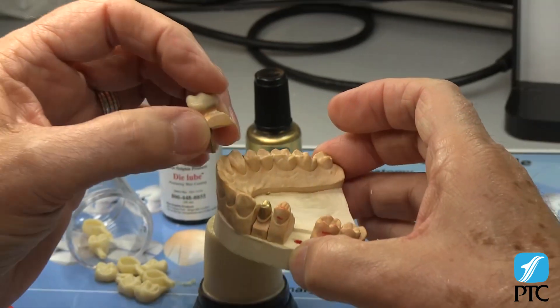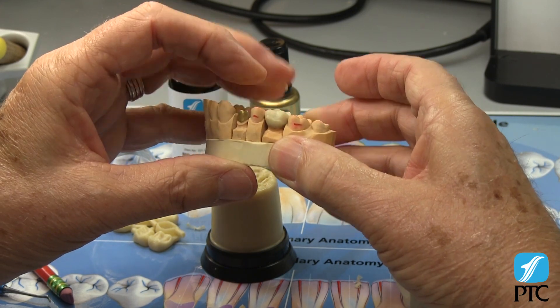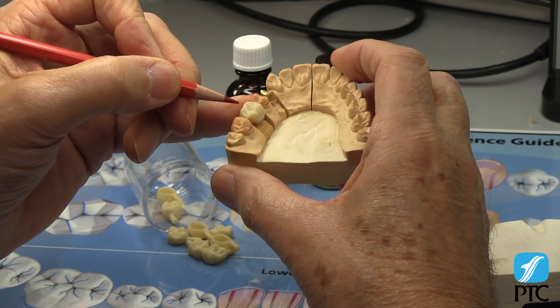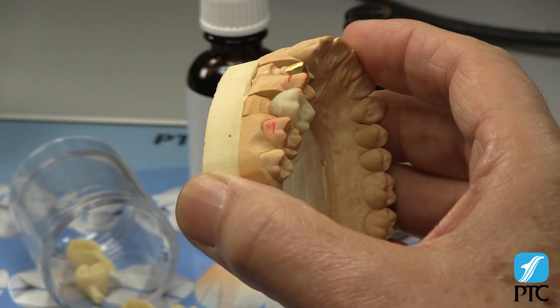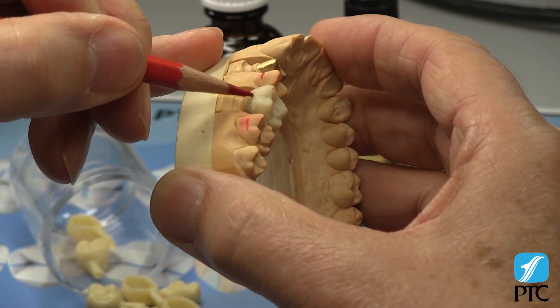Place the die back on the model and mark on the wax the ideal cusp tip locations and the buccal and lingual heights of contour that match the adjacent teeth. These marks will serve as a stable reference to enable you to make quick, accurate decisions on how much to carve to reduce the wax pattern to the perfect size.